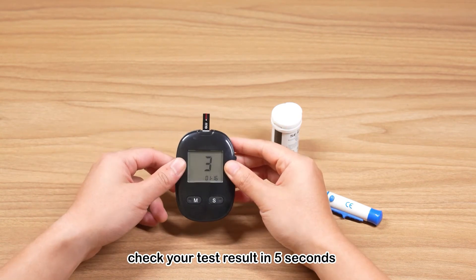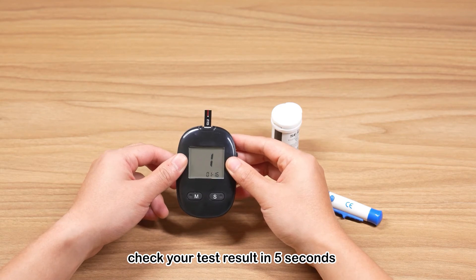Wait for five seconds and check your blood glucose test result along with the date and time of the test. Tests will be automatically stored in your meter.